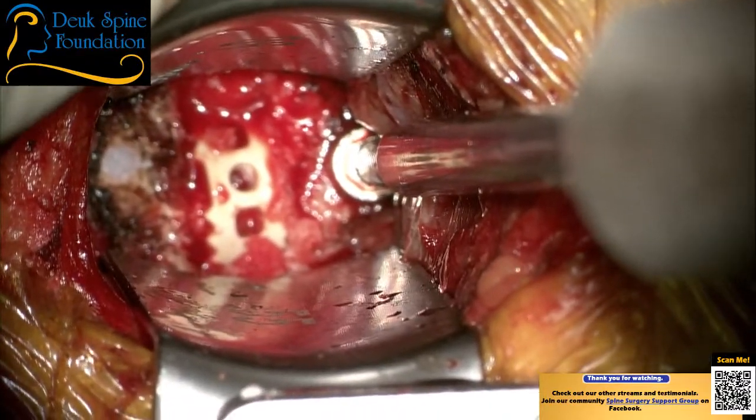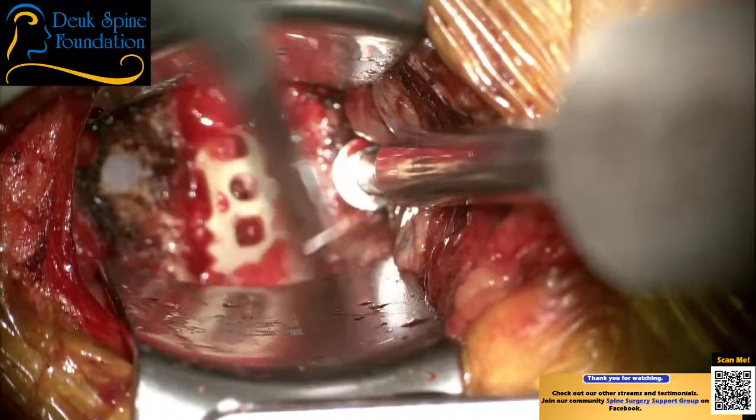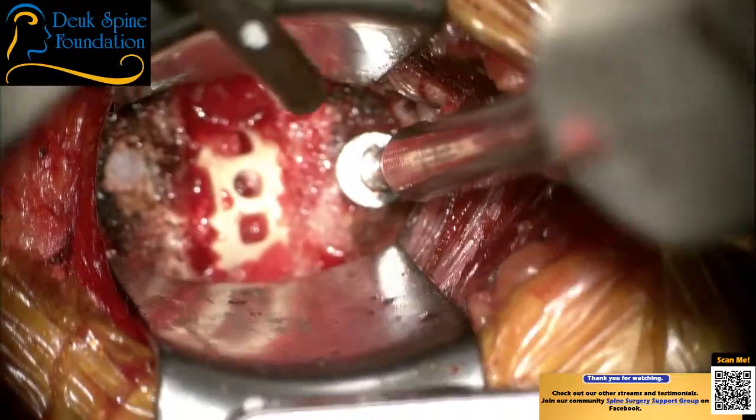I need a Penfield one. I don't want to grab all that soft tissue when I go down. Come on. You should know what I use. I use the same thing every time, Luis. You've done these with me.